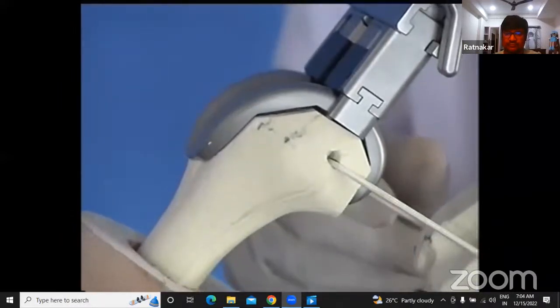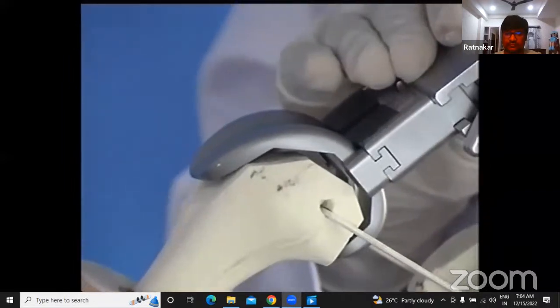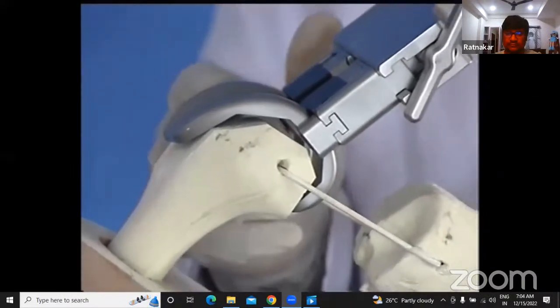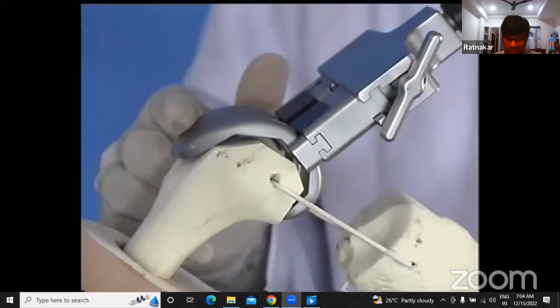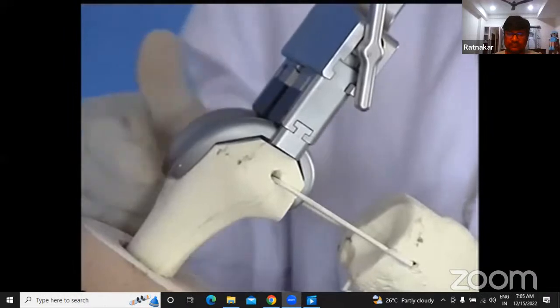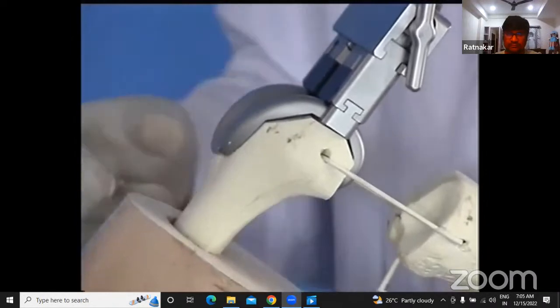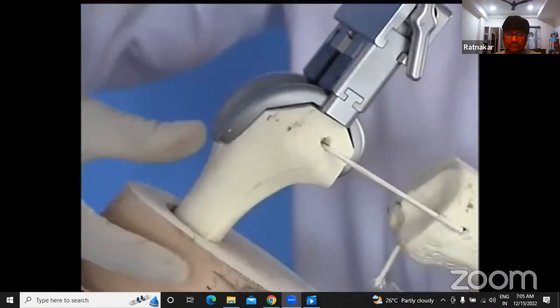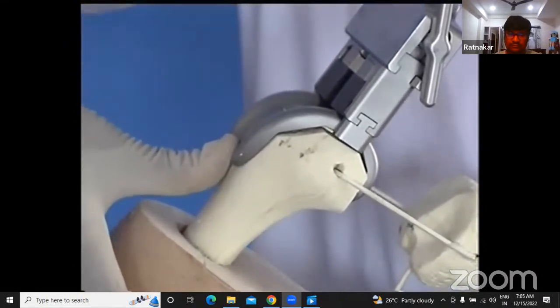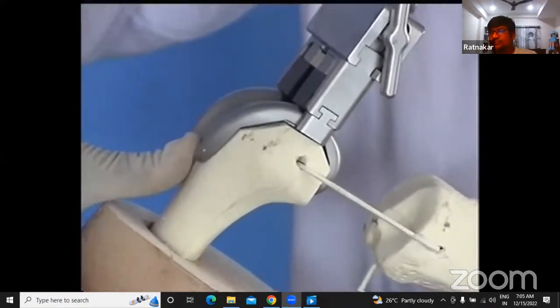One point of caution here is, when you are seating the femoral component, if your cuts are not right, or if your seating is not right, you might end up putting the component like that, which is a flexion attitude of the femoral component, which is to be avoided by all means. There is no worry of putting this in extension, because the anterior cortex will prevent that. One practical tip here: when you are seating the femur with the cement, ask your assistant to hold it with the thumb and press this component to the femoral cortex. Then your seating will be appropriate.